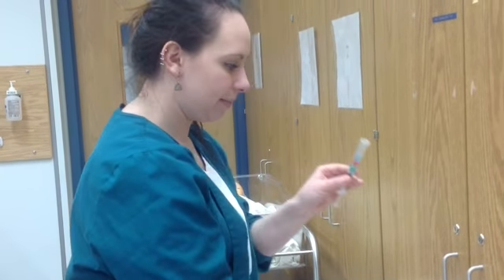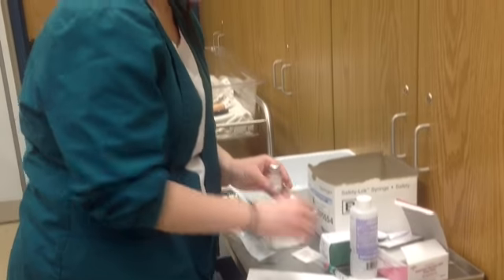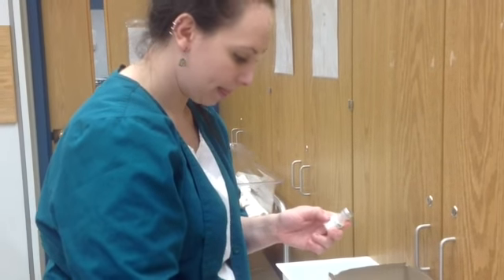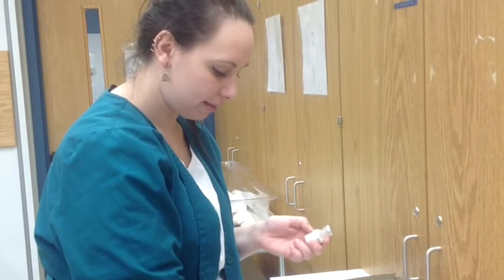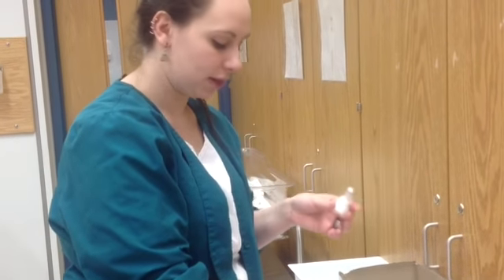So I'm then going to take this. Don't lock the shield because then you can't get it open. I'm going to put it down. I'm going to again double check everything while I go to put this away. So Bacillin, it matches the right drug. I got the right dose, the right units, mLs. I converted it to 1.2 milliliters needed, so the right dose is there.